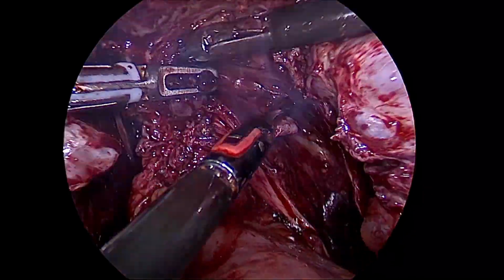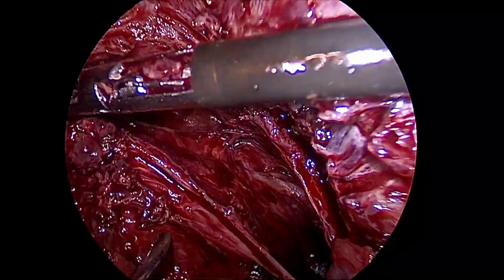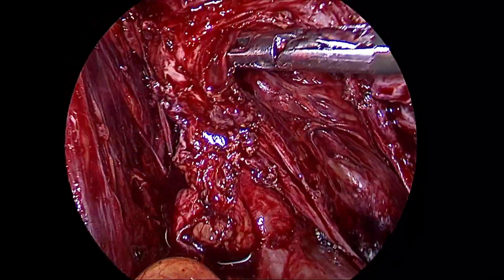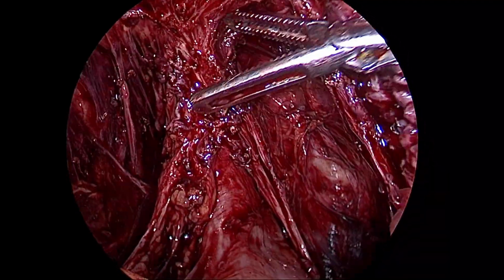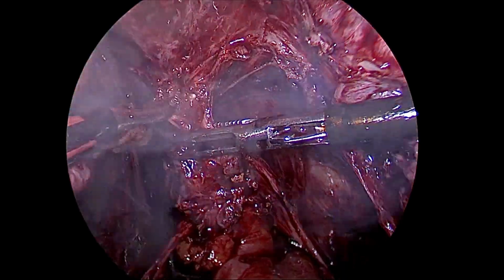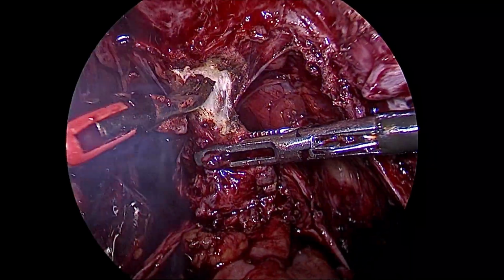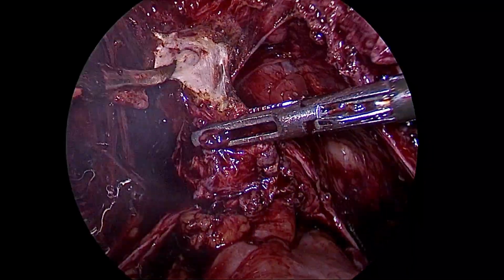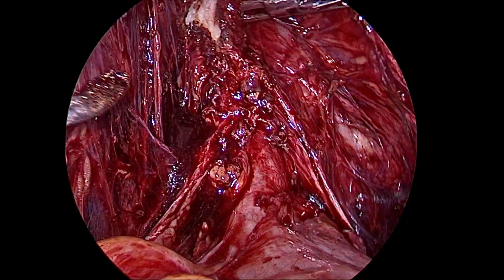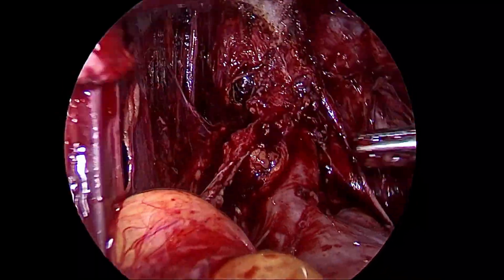I am using a Karl Storz Image1 S Full HD camera. I do not use a 3D camera. This entire surgery has been done on a 2D camera, and for the sake of reducing the time of the video, this video has been recorded in 2x speed so that people can go through the video. In case you find any of the steps very fast, maybe you can reduce the speed of the video, thereby you can understand what exact steps are done.